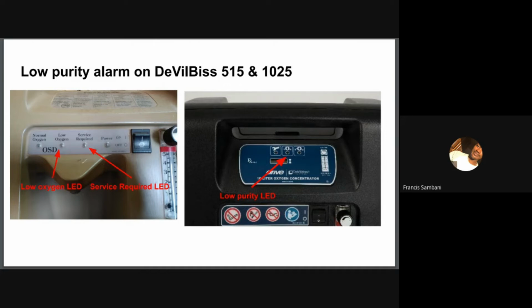So yeah, the 15-minute stabilization delay is when you just turn it on. And the 10-minute stabilization delay is for the turn down mode. Okay, so let me just say what the turn down mode is.